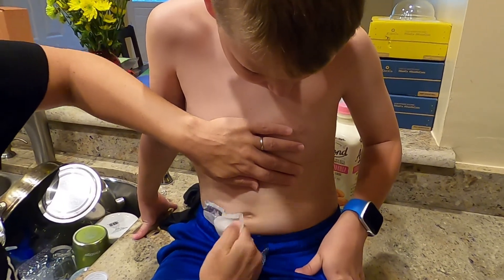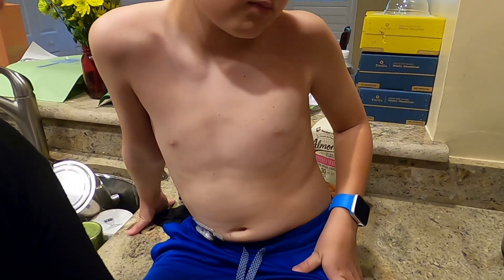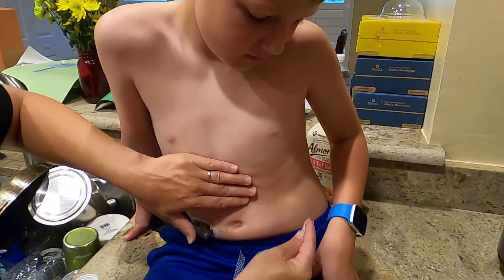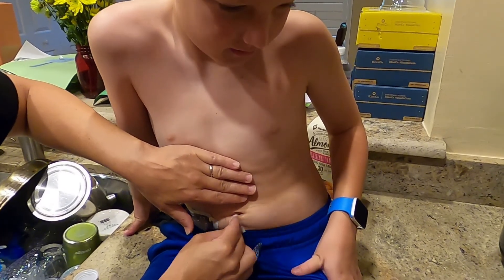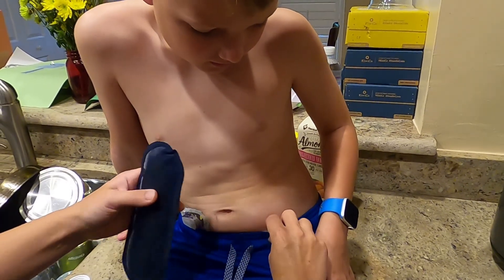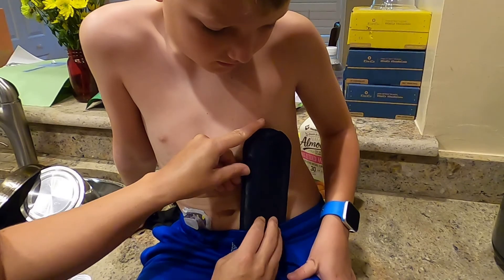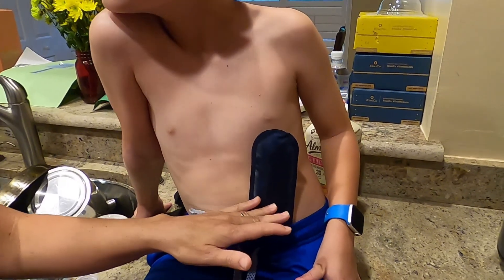And we're just going to clean it up kind of gently. We do use an alcohol swab just to make sure that his skin is nice and clean. I do it really gently because these are not super soft. Just so that the adhesive sticks really well. And then we put an ice pack on it, and then we just let Abel tell us when is enough ice.